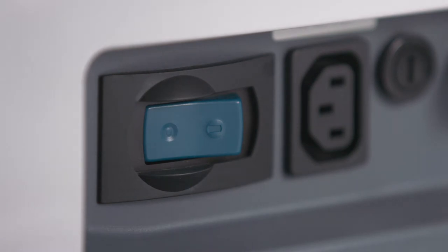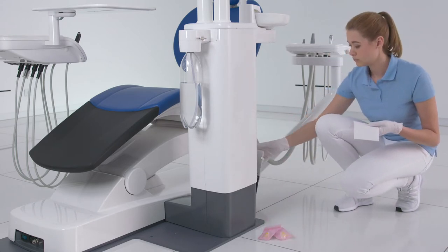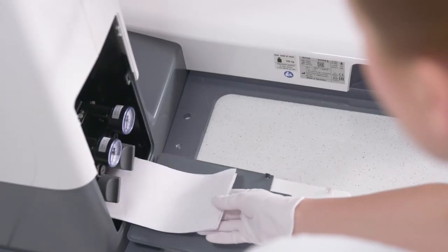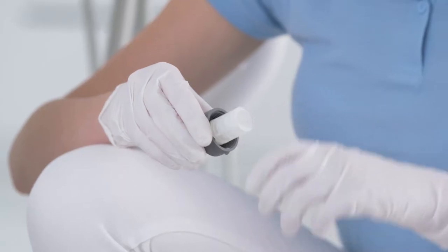Switch your treatment center off at the power switch to replace water and air filters if you note changes in the media flows. Any remaining water will flow out of the water filter when it's opened, so you should place an absorbent cloth underneath the filter. Then remove the screw and cap of the water and air filters and replace the filters.